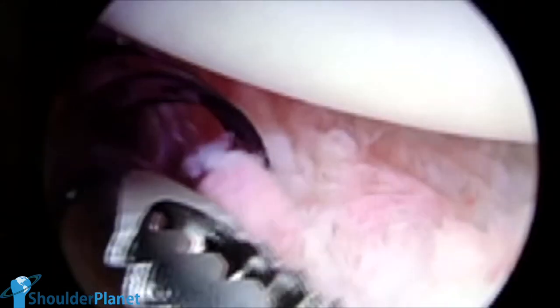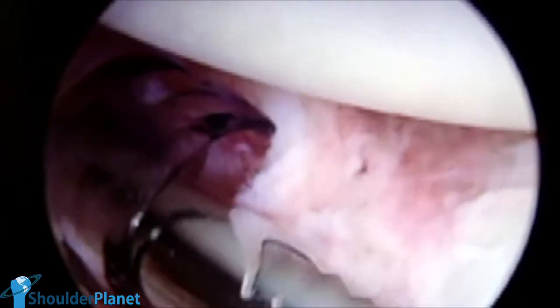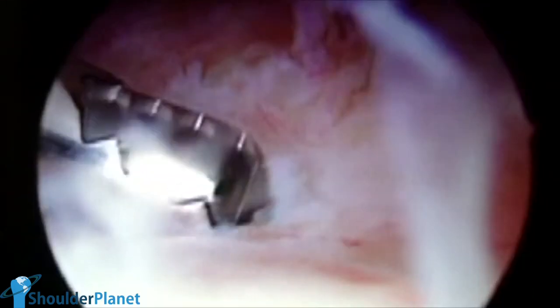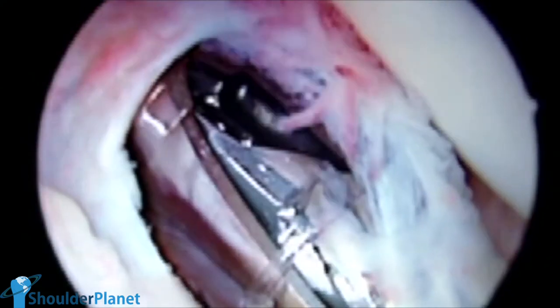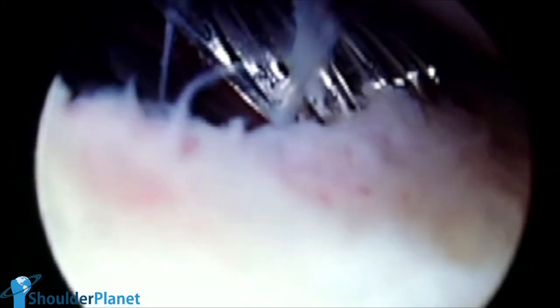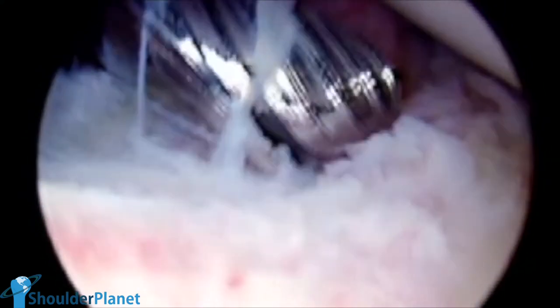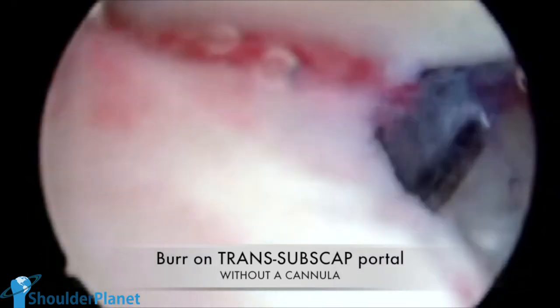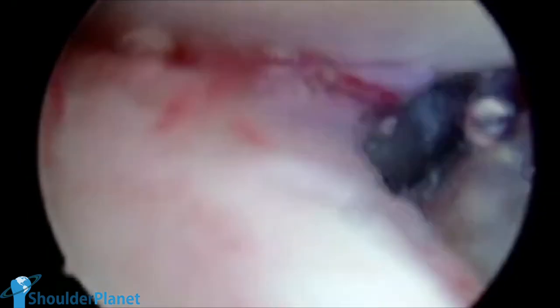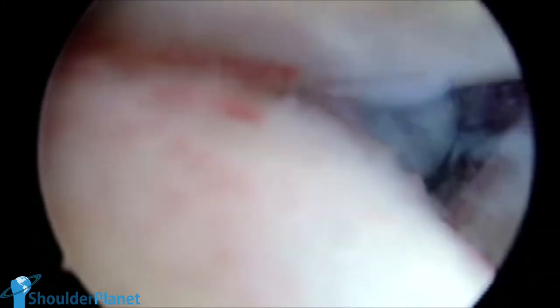Once we found the HAGL lesion, we continued to debride the inflammatory tissue and would have to do so to have enough space to try to put an anchor. We entered first with a burr, but it was quite difficult, as we are seeing now, to find a place to create a bony bed in which we would put our anchor. We noticed that it was very hard to have a nice view with the camera in the posterior portal, so we changed the portals — now the camera is in the anterior portal. We put the burr without a cannula because it was easier to move, and we started to create a bony bed in which we would put the first and probably the only anchor in the humerus.